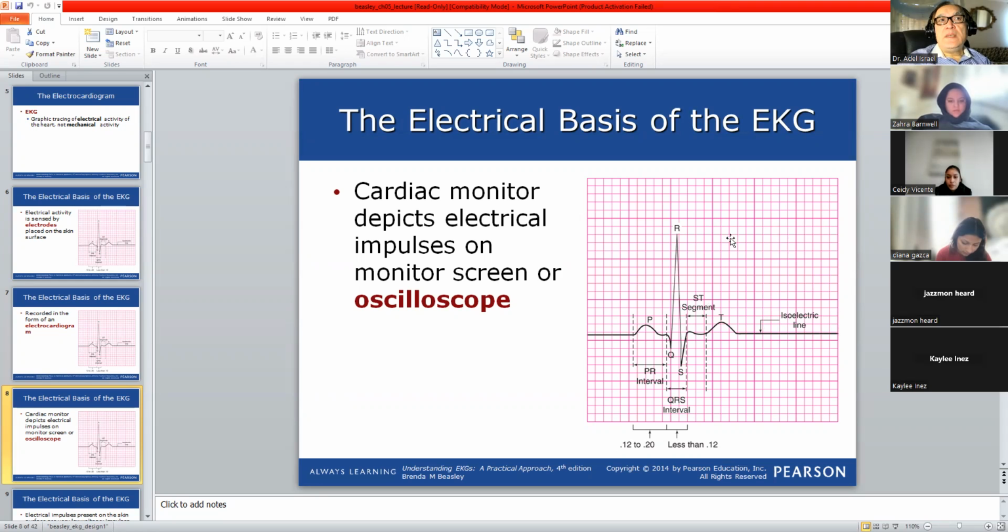Who will make this drawing? The oscilloscope. What is the oscilloscope? If you open the machine which we practiced on, you find there is a pen or something drawing, making an up and down wave, like the Richter scale which measures earthquakes. It is the same. Here it is attached to the electrodes and to the machine, and according to the electricity coming from different parts of our body, it will make these waves, and we are going to study these waves.